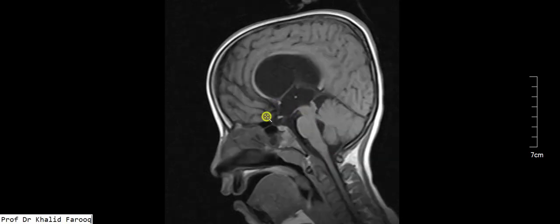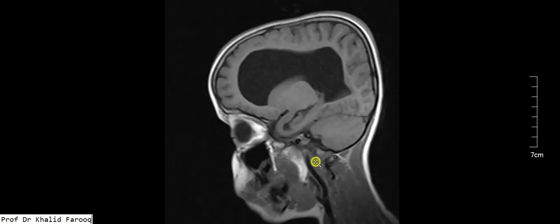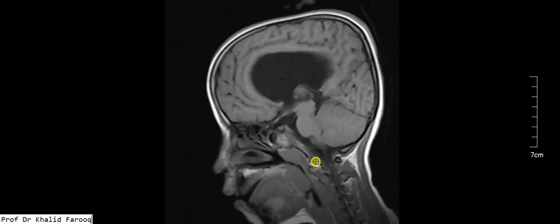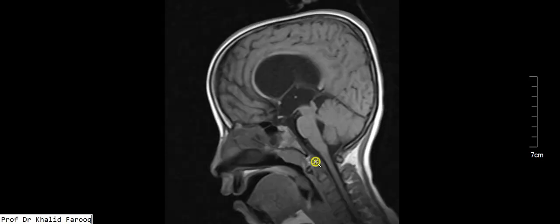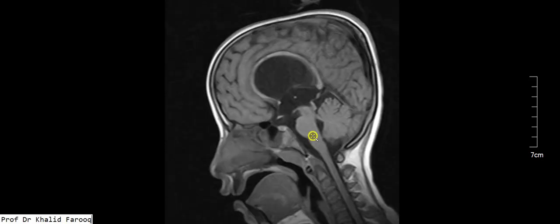The lateral ventricle is also dilated, so this obstructive hydrocephalus is because of stenosis in the lower portion of the cerebral aqueduct. In this case, CSF flow would be through the floor of the third ventricle into the interpeduncular and prepontine system.